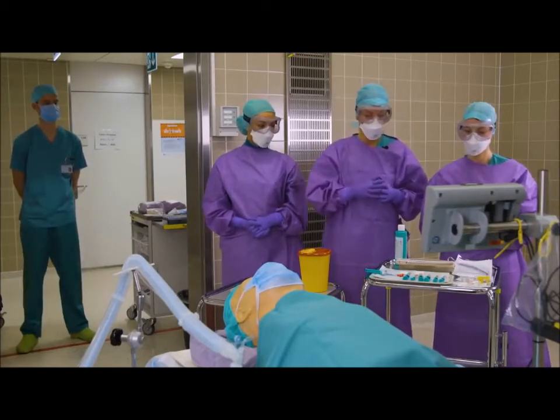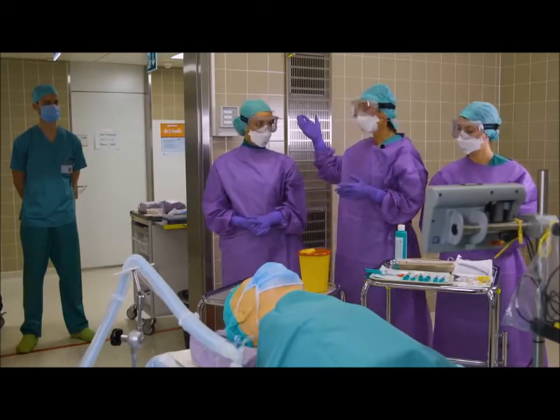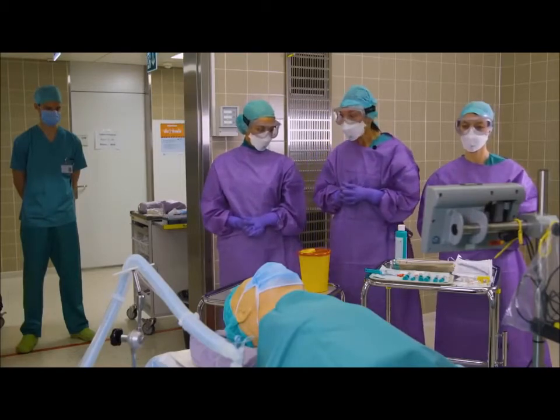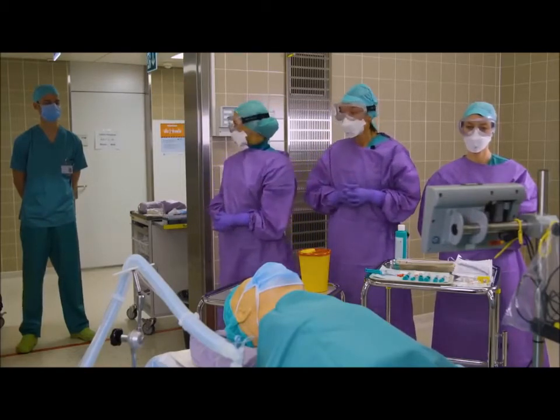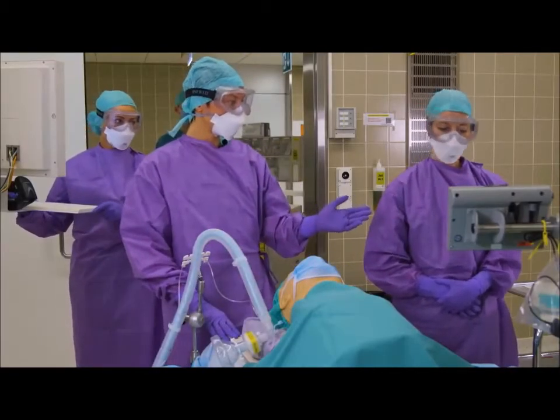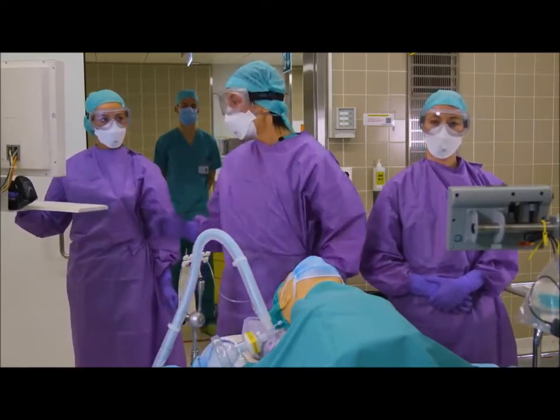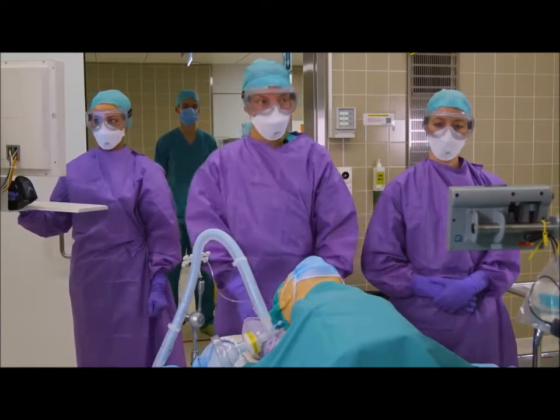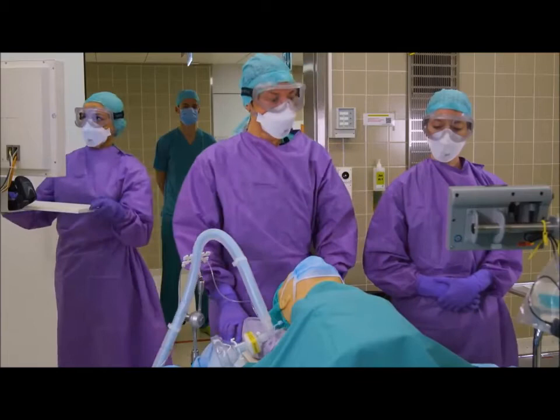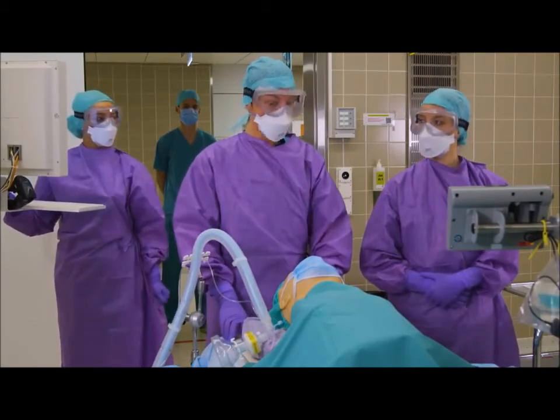Outside we have Tim, who is our clean person and jumper. In case we need medications or airway material, he will be able to hand them to us. We designated our roles clearly, with Larissa being the medication person and airway help, Manila doing the documentation, Tim outside as a clean person, and myself as a seasoned anesthesiologist doing the airway.